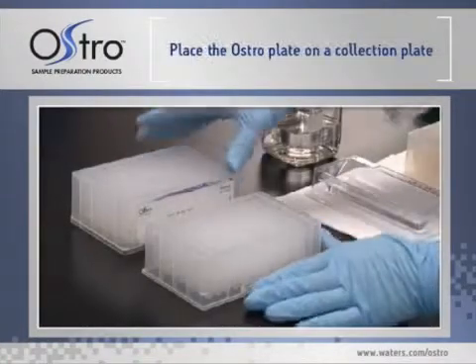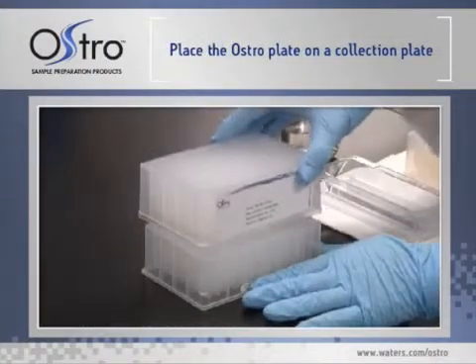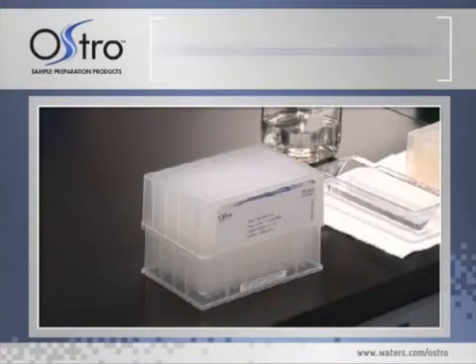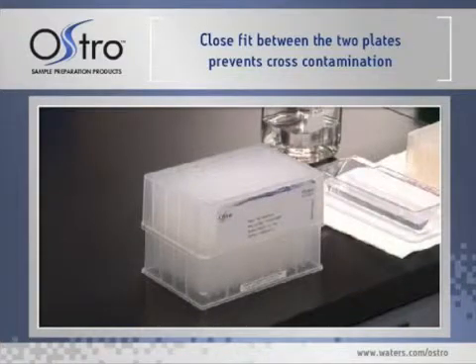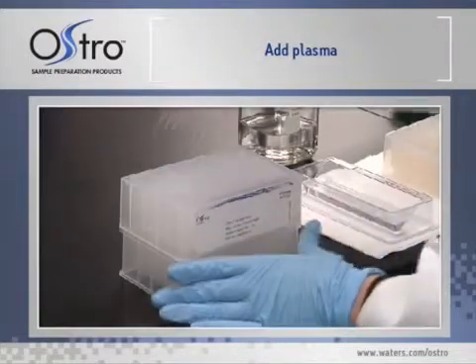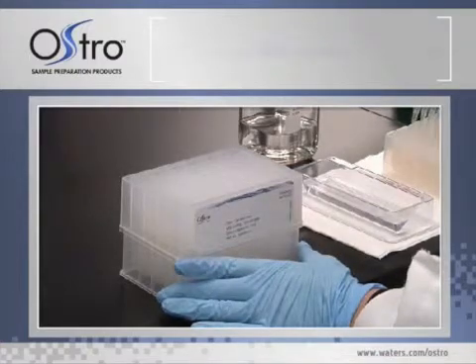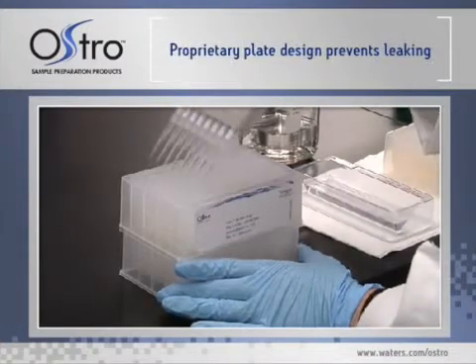First, place the Ostro Sample Preparation Plate on a collection plate. The Ostro Plate has been designed so the tips extend into the wells of the collection plate, fitting closely and securely to prevent cross-contamination. Add between 50 and 200 microliters of plasma into the wells of the Ostro Plate. The FRIT design prevents leaking.